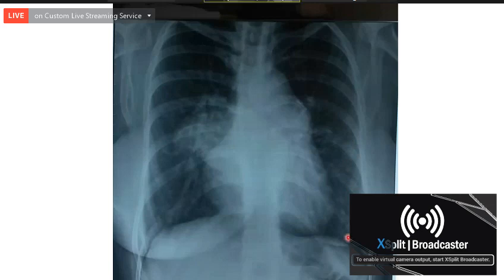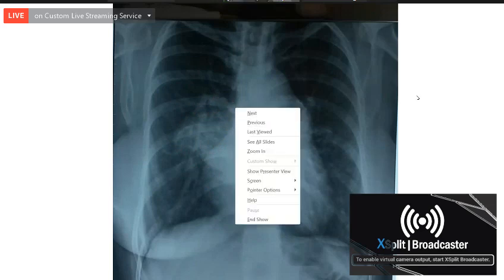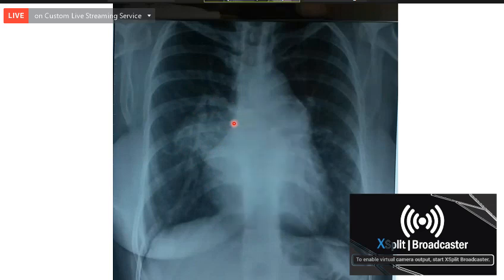So why the pulmonary here? You have the large vessel here. What does it indicate? Branch PA stenosis. Okay, you can consider that. Why do you want to say branch stenosis? You can say that this indicates a huge pulmonary artery, a dilated pulmonary artery. Yeah. Anything else?